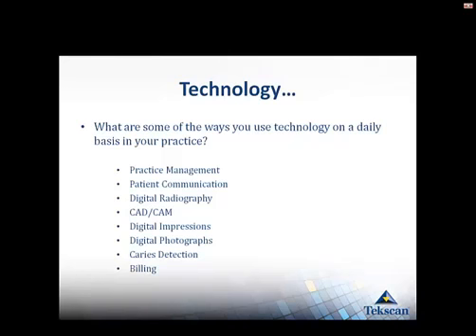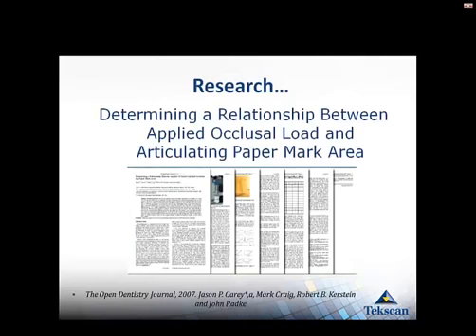From the moment the patient walks in the door, you have them in a practice management system. You might be taking digital photographs on them. And then from the time they leave, with the billing process, all of that is done digitally. And so Tekscan is an easy fit within that part of your practice as well.